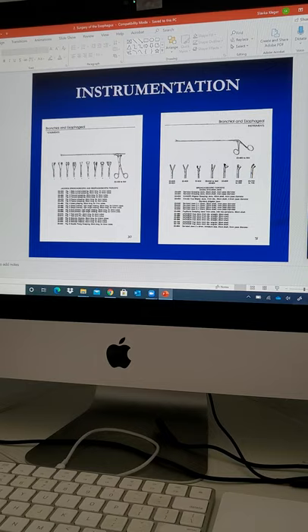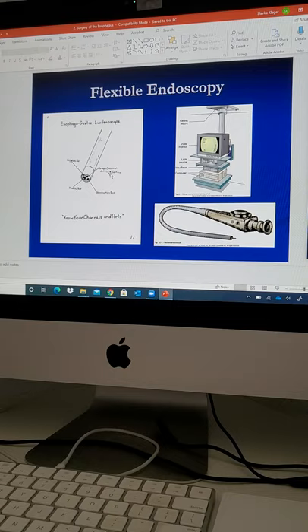The four ports for the flexible endoscope, and then there's the instrument port where you put the instruments through. And then it's suction, and the last one is irrigation aspiration, right? Yes. Okay, you got all the four ports.